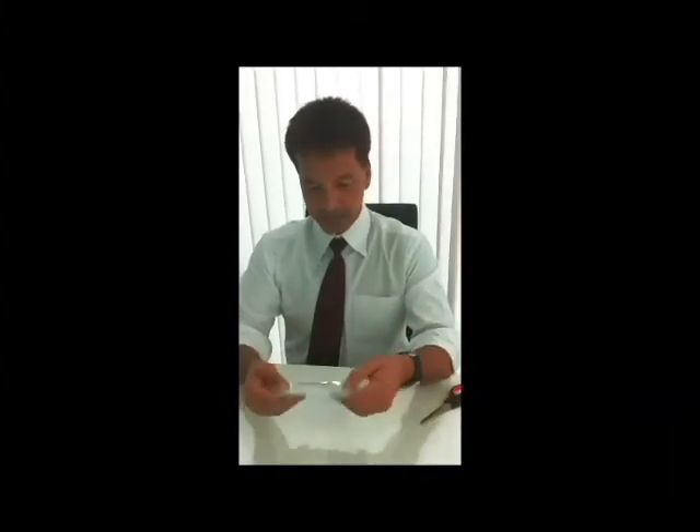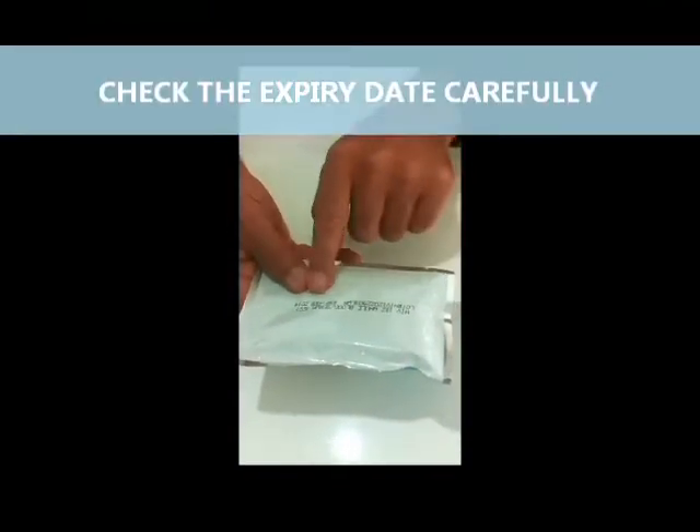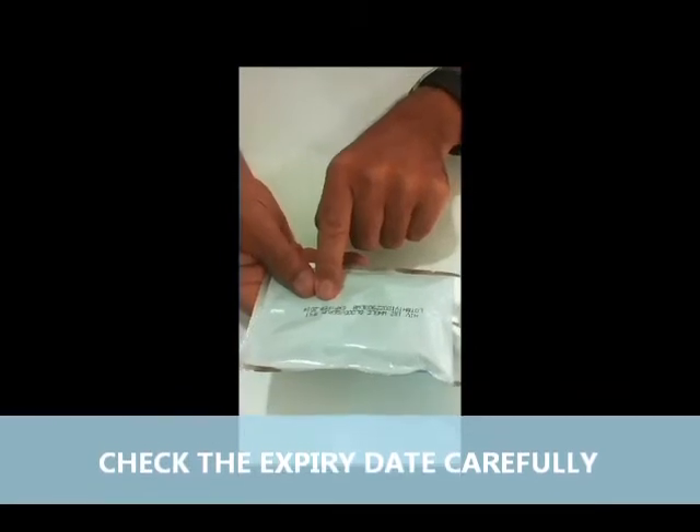In this package here, we'll open it up and double check the expiry date. It tells you it's an HIV test kit for whole blood serum, and this one expires in February 2014.